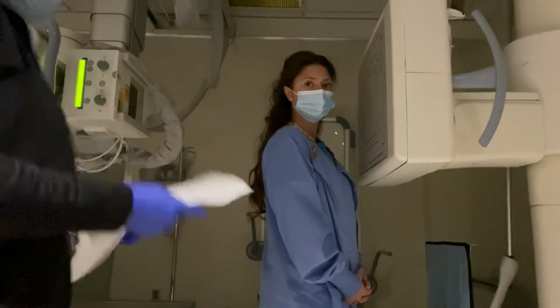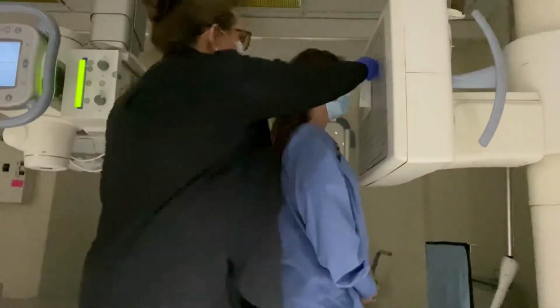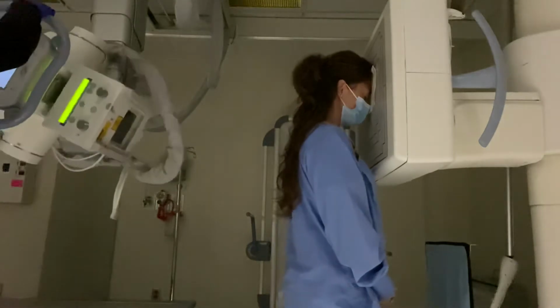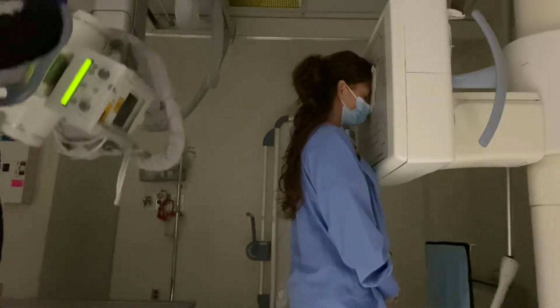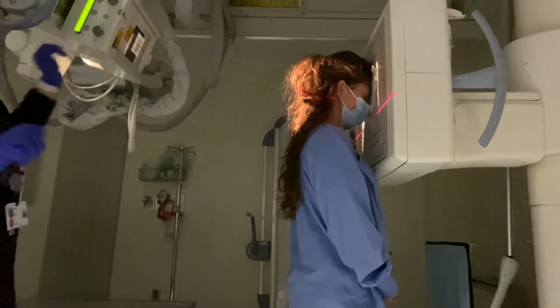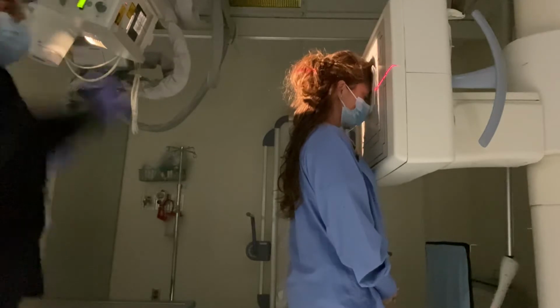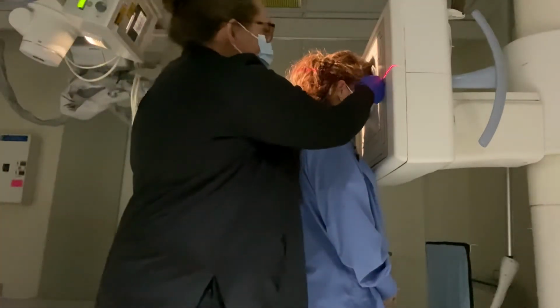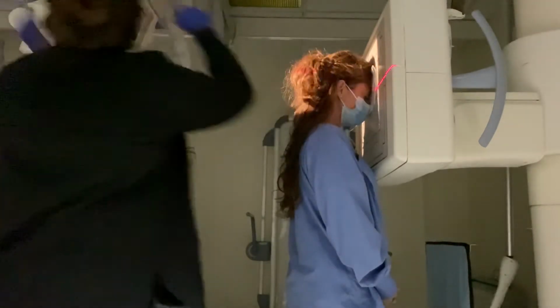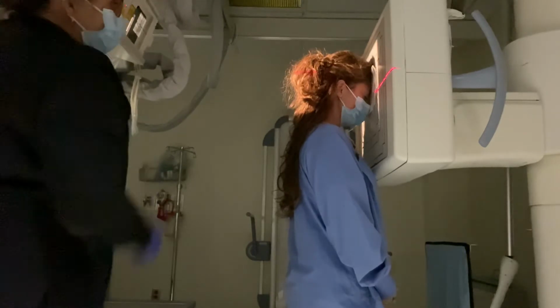you're gonna have your patient put their forehead and nose on the board. So I just asked them, go ahead and put your forehead and nose right on that board. You want to angle your tube 15 degrees towards the feet. Now sometimes you have issues with your patient's height, so you might have to set them down. We want to center with our central ray exiting at the nasion. So you're kind of looking here through the side to see where the central ray is exiting. Make sure that it's right on the nasion.